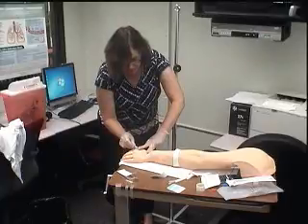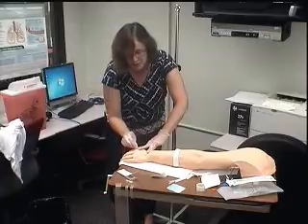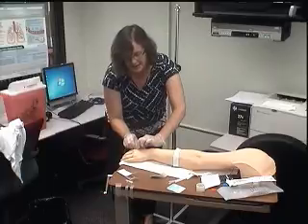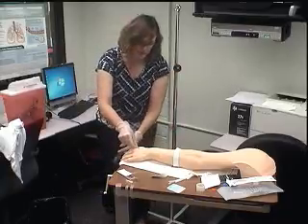I'm going to hook this up. I'm holding pressure here. It's preventing the blood from flowing out and making a big mess. I put it on. Once I got that on, I can help to tighten it like this. Now, so I push it in and I screw it to the right, turn to the right. Righty-tighty, lefty-loosey. Now it's on.